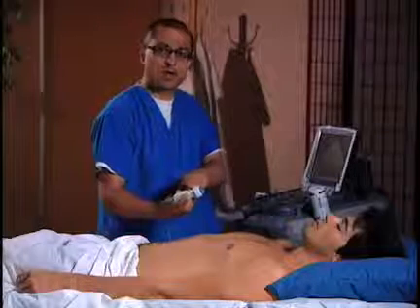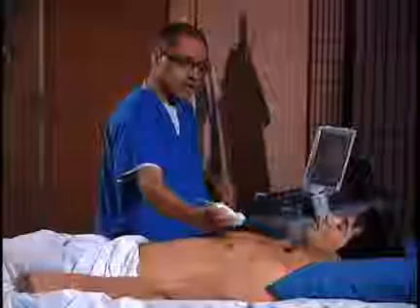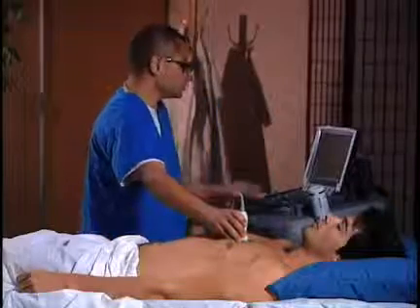Here's our probe marker right here. We're going to aim that toward the patient's head, and I'm scanning right now in a sagittal fashion. I'm going to turn my gain up a little bit, and the first thing we recognize is that our depth is too deep. Remember, what we're scanning now is really superficial. We're looking at the lung surface. So I'm going to decrease our depth so we can see the lung surface quite easily.